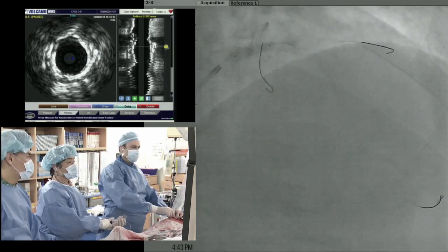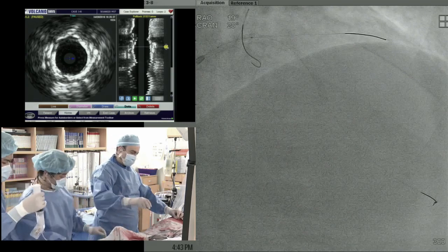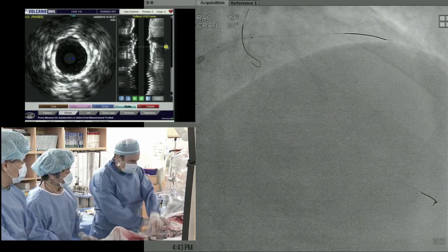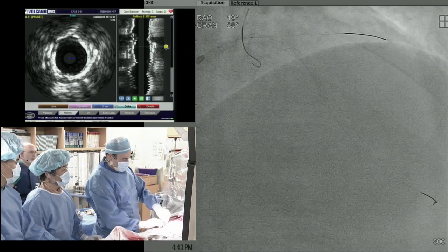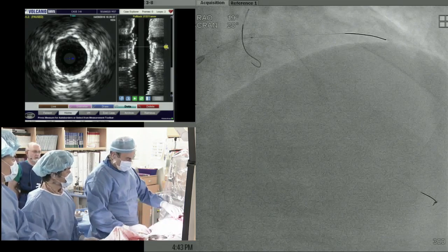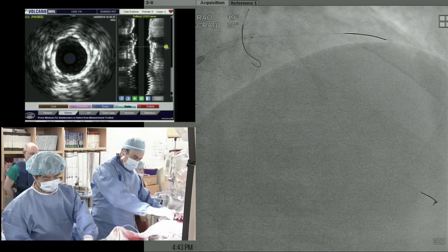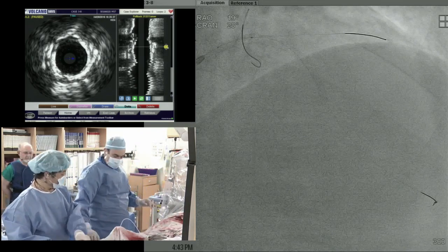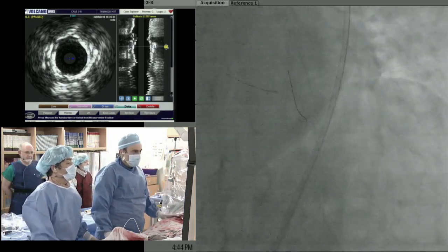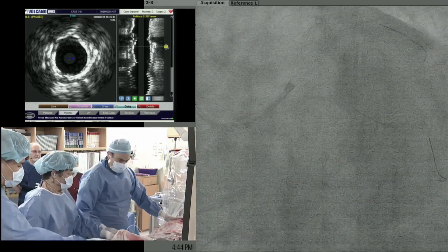Good. Okay, down. We'll give you a spider now. And then we'll IVUS one more time. The question was about the stent struts. Open the stent strut to the circumflex because downstream there's some borderline lesion. In the future, maybe we need to fix that circumflex if any progression. I don't know. I've heard so many different opinions about whether this is of any use or not that I'm totally confused. I'll tell you a story in a sec after we take this picture. Go ahead. Ready? Okay, I'm ready.